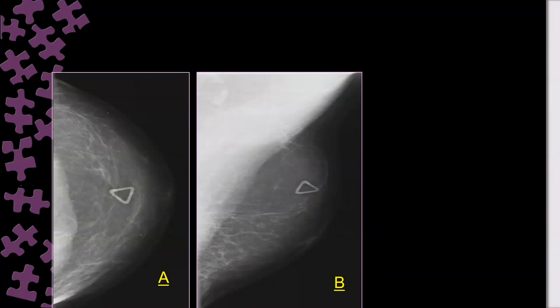There is a palpable abnormality. Do you suspect this patient has a lump or no? Having a mass or no? Yes. What is the mass? More lucent here. That mass is so lucent, overlying the pectoralis. Who said the lucent? Sarah. Excellent. You are right.